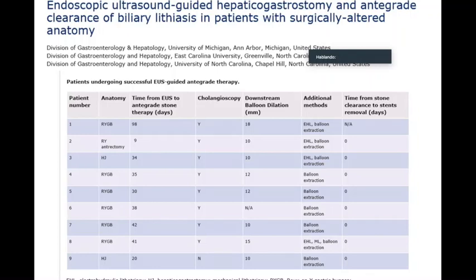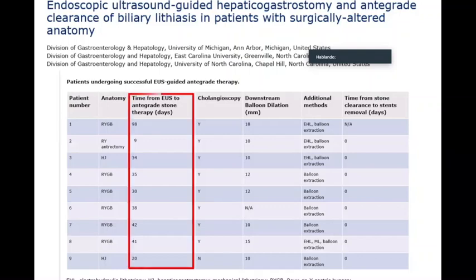But for the big stone, they sometimes take almost 100 days. It is necessary to create the fistula, and after that, they dilate the fistula. Then they employ the EHL, and sometimes the small baby scope, EHL under the baby scope, like this. It takes a long time.